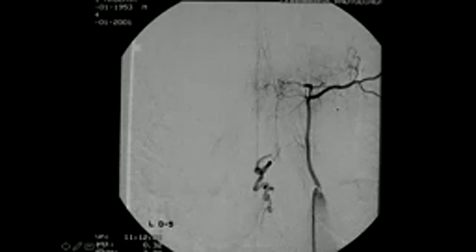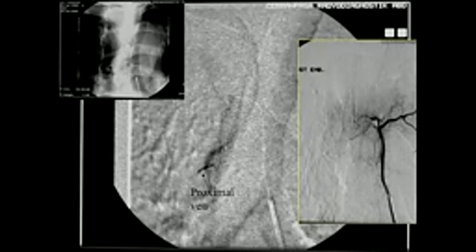Time to time, the anterior medullary arteries arise from the feeding arteries of the radiculomeningeal branch. In those times, it is better to send the patient to surgery if you don't deal much with liquids. The surgery is the best. But if you have a good stagnant flow with your microcatheter and you really have the hands to inject, you can do it. It is an old case, 2001.